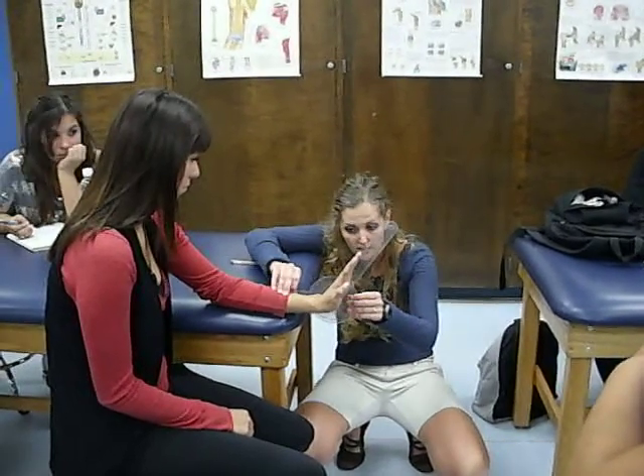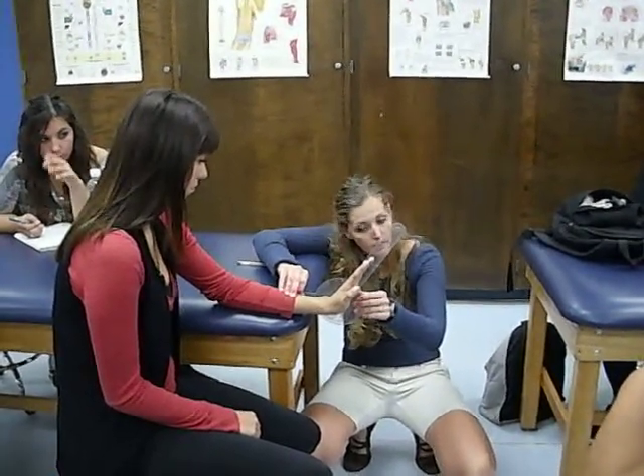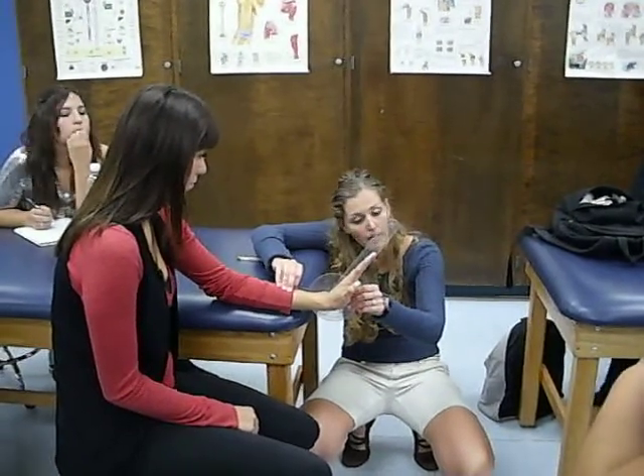Because if your axis is further down, you could go on the fist, but it's not. Your axis is a little bit further up, so you're going to go parallel with the fist.